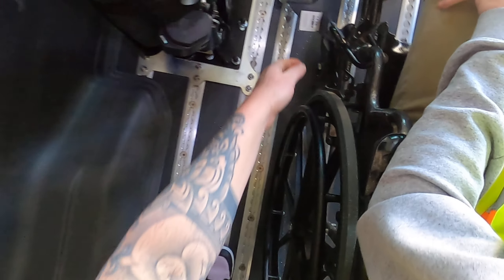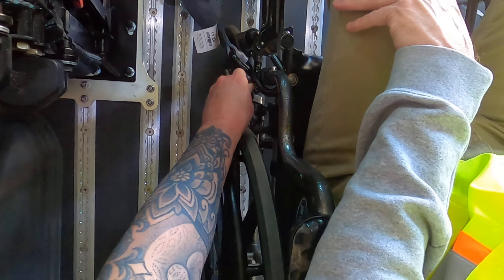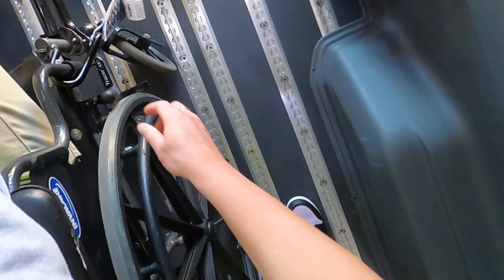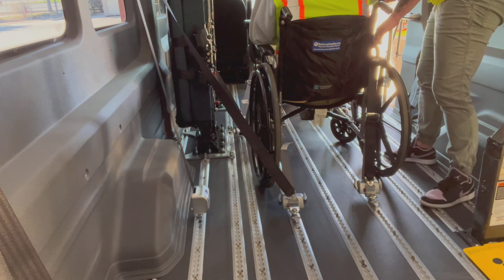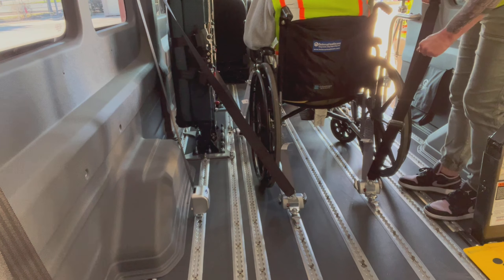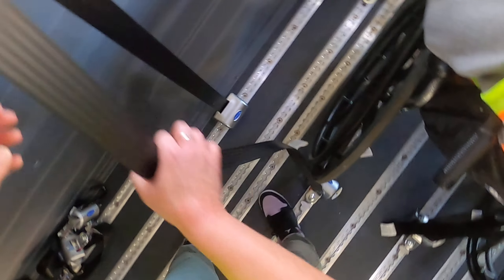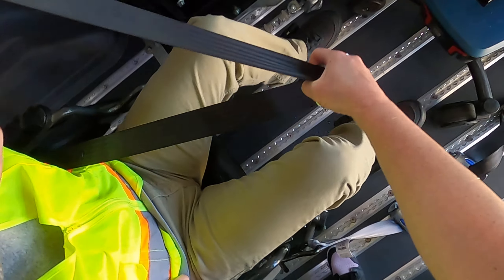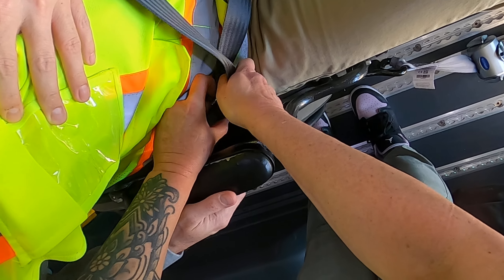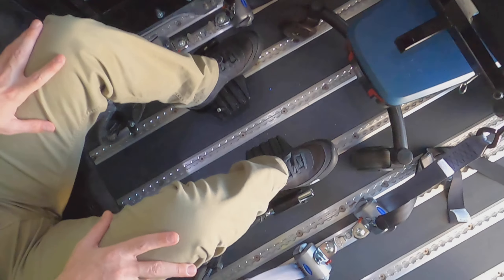This time, I'm going to check for movement. I release the brakes and do the push-pull test. Looks good — let's reapply those brakes. Now I'm going to secure Walker using the lap and shoulder belt. First, I get the buckle side to the proper length — we want it right on the hip. For the other side, you want the belt right next to the body and not going over the arms of the chair. This chair also has a gap that I can slide it down. I bring it across his torso and buckle it in. When you are done, always make sure you have four floor securements and your guest feels safe.